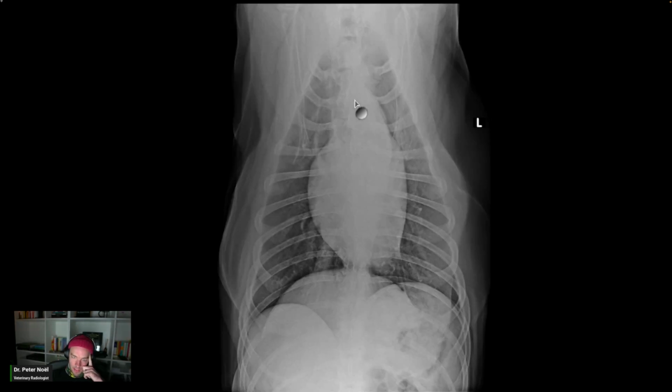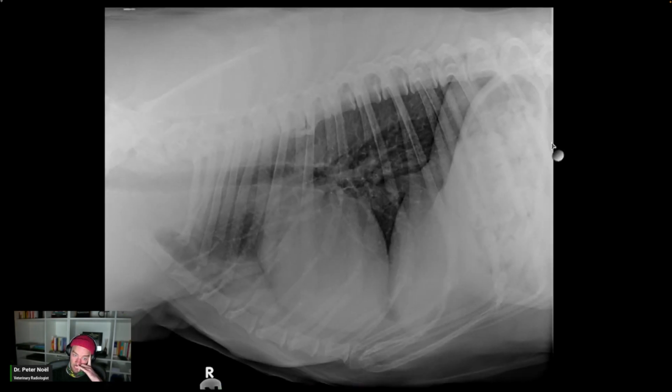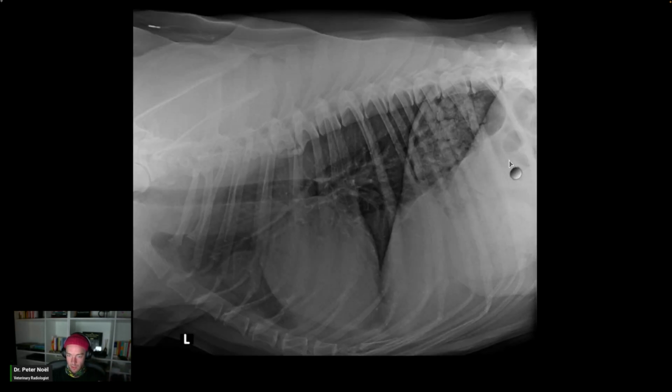To me, this is a pretty straight radiograph. Yes, it's a little bit rotated, but I think it's darn good. So I don't have really any complaints about the positioning on any of it. I think this view's a little underexposed. You could turn it up a little bit, turn up the oven. This is a pretty good study. Nothing's washed out. I can see the mass.